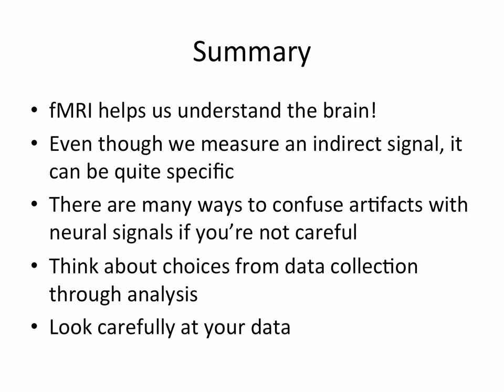I think the field's finally been embarrassed. Probably about 10 years ago, the field got embarrassed enough that enough people realized that they have to look at the raw data, but that's the most extreme example. You really have to look at your raw data, look at your time series, look at unthresholded statistical maps, to really get a sense of what's happening in your data.